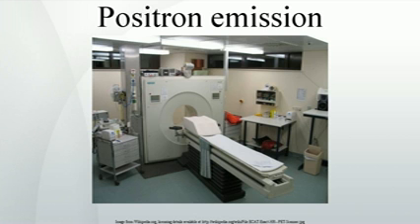Because the half-life of fluorine-18 is about 2 hours, the prepared dose of a radiopharmaceutical bearing this radionuclide will undergo multiple half-lives of decay during the working day. This necessitates frequent recalibration of the remaining dose, determination of activity per unit volume, and careful planning with respect to patient scheduling.